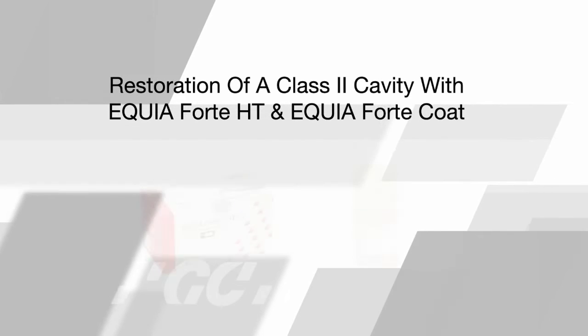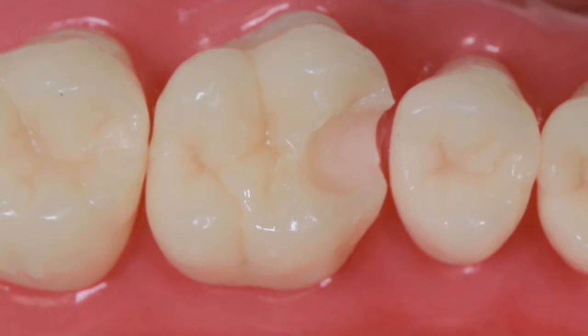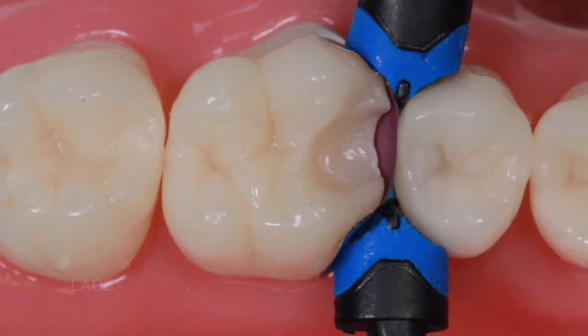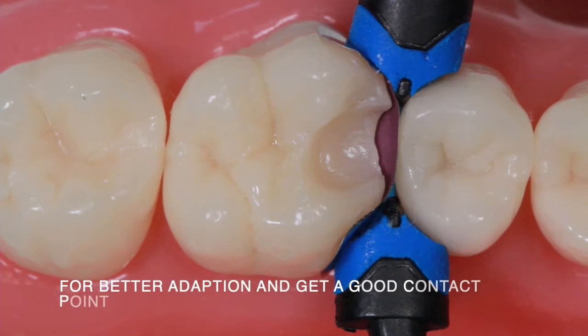This video shows the restoration of a class 2 cavity using the Equia Forte HT. Place a sectional matrix and an anatomical wedge for better adaptation and to get a good contact point.